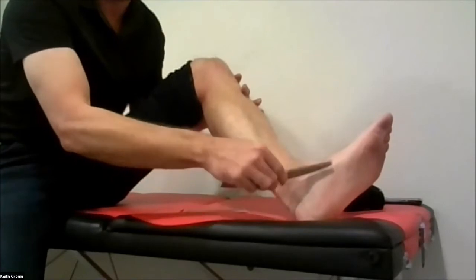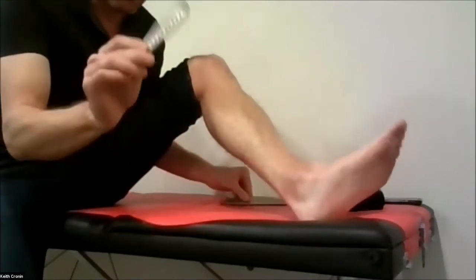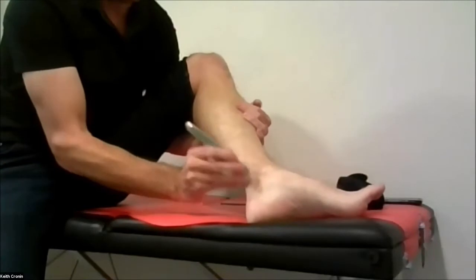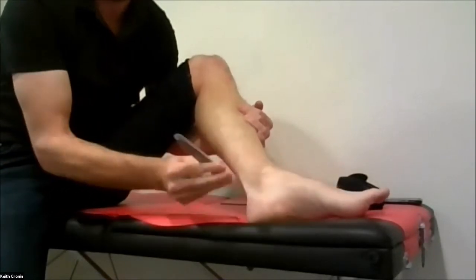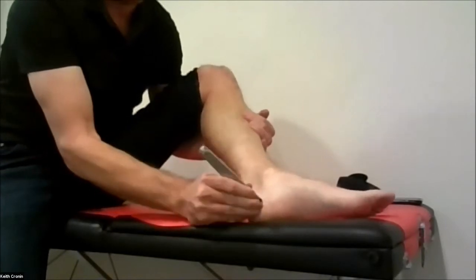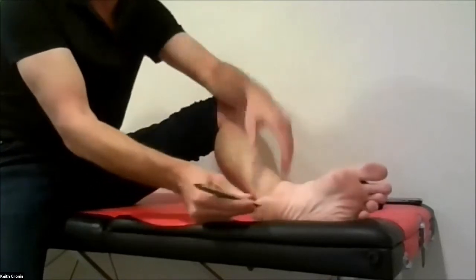Now you get to a part over here and you're like, well, wait a minute, Keith, I can't work on this spot here. The tool's too big. So, yeah, that's why there's multiple tools. That's why we have a different set of this, because this is going to allow me to work up and around the soft tissue. So as an example, if I was having that plantar fascia pain, I could work right down into that aponeurosis that goes around the soleus and the Achilles. I could work down into the tissue, particularly that you're going to see down in the heel.